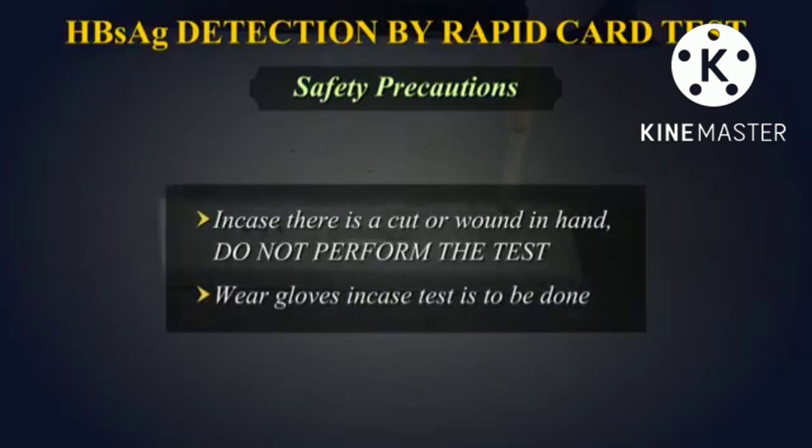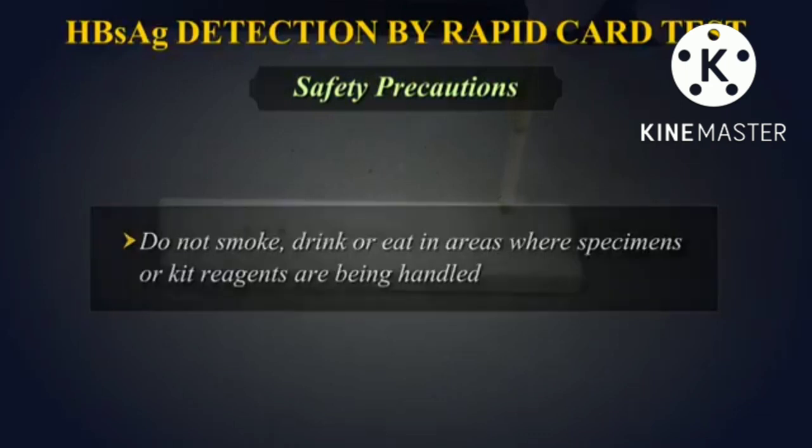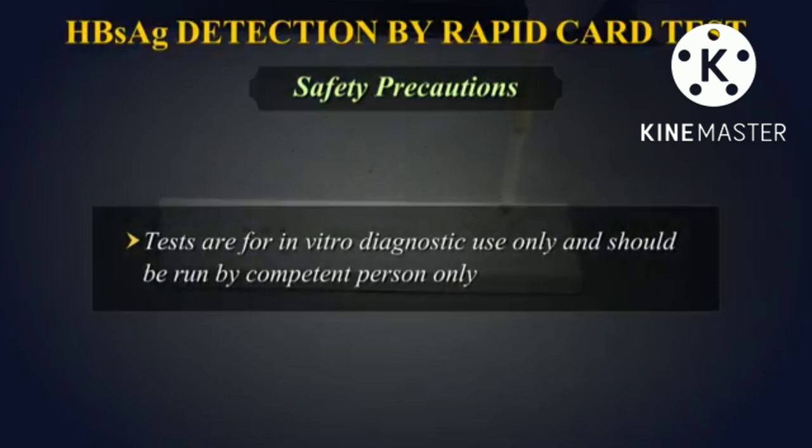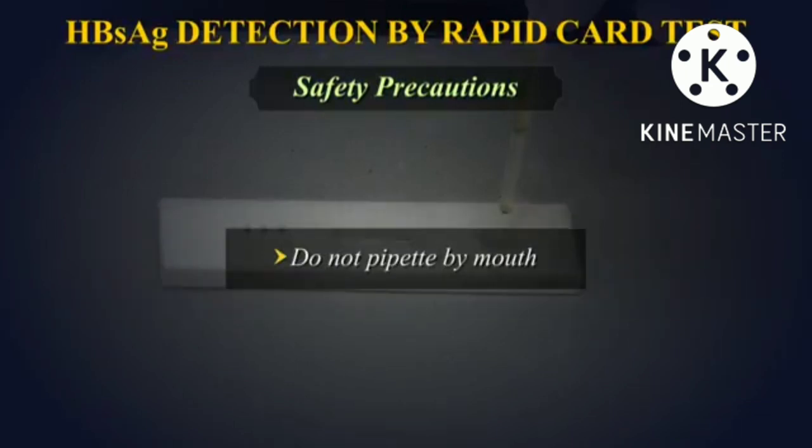In case there is a cut or wound in hand, do not perform the test. Do not smoke, drink, or eat in areas where specimens or kit reagents are being handled. Tests are for in vitro diagnostic use only and should be run by competent person only. Do not pipette by mouth.